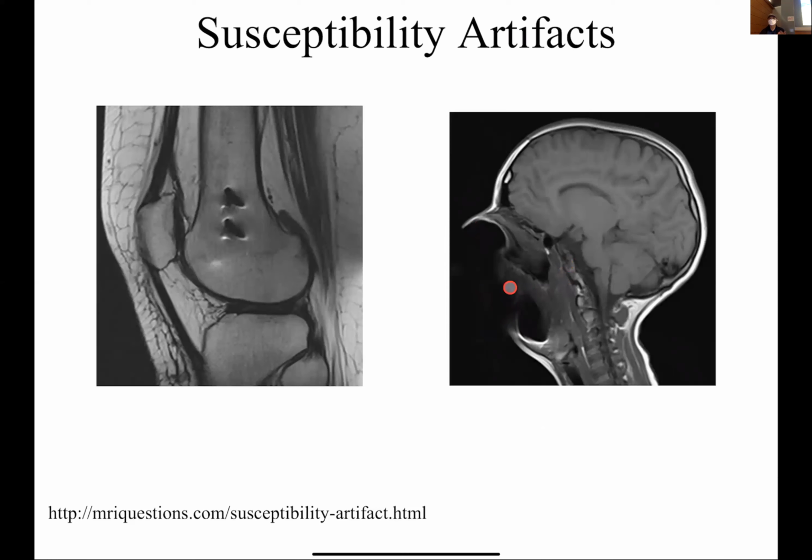Like, what do a lot of teenagers, you go to the dentist and what happens? You get braces, right? So this person probably has a lot of dental work. Probably a lot of the old-fashioned braces, not the new Invisalign or whatever the latest thing is, right? There's probably a lot of metal in their mouth, which is going to perturb the magnetic fields quite a bit. So this person should never have gone in an MR scanner in the first place, right? But they did. And this was the image.